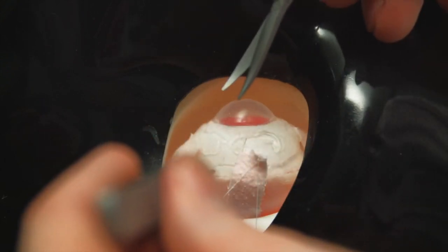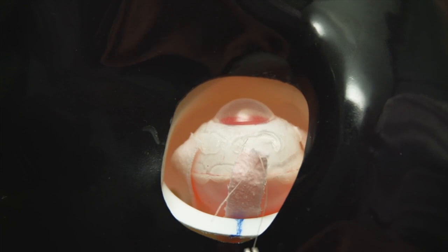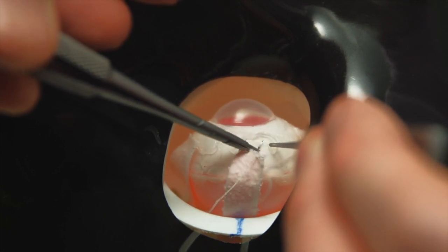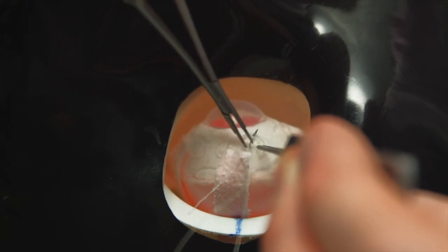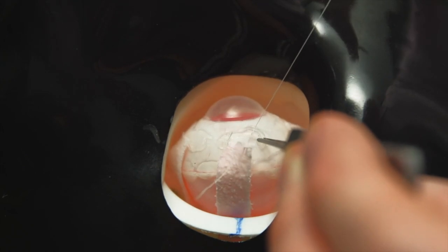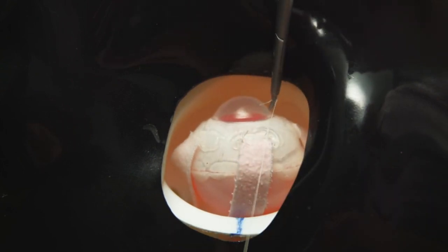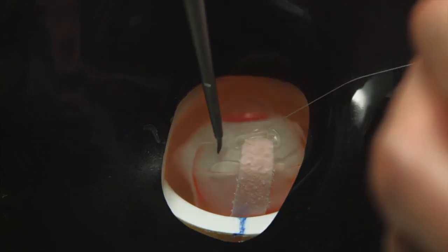Now the superior pole of the muscle is reattached to the sclera. We emphasise the importance of a good spread of the muscle to prevent any muscle sag. Muscle sag is very difficult to simulate with the model eyes, but the principle of spreading the muscle along the original insertion is an important one, which will stand the trainee in good stead when they transfer to live surgery. Secure suturing technique ensures there's no slippage of the muscle from its intended position. A little bit of gentle traction on the lateral rectus or the medial rectus can enhance the realism of the simulation. Finally, the suture is just being trimmed at a safe length from the knot.